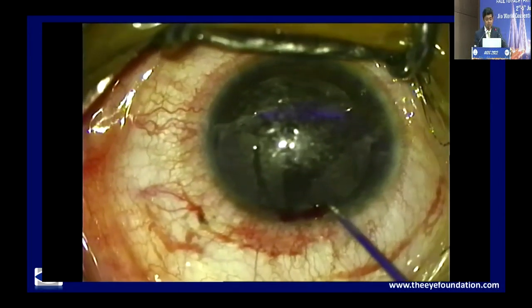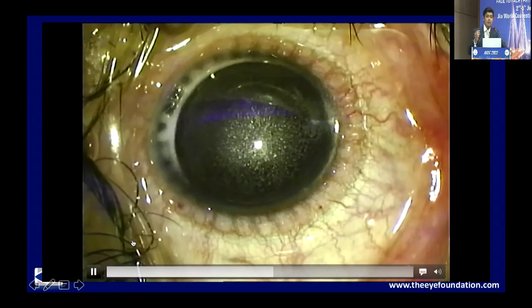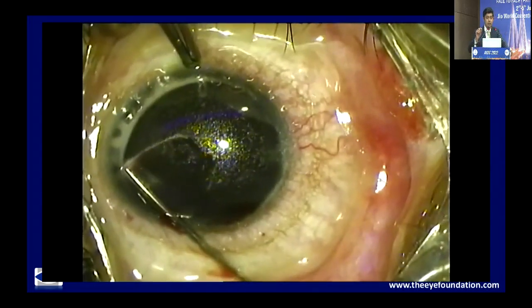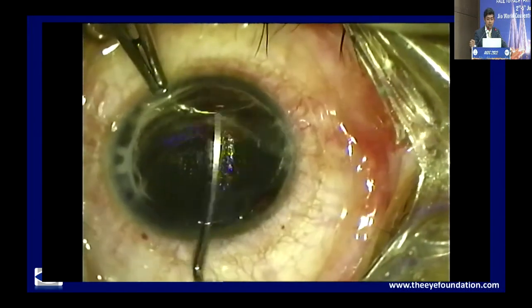And you can see that bleed there. Rest of it is quite similar. I'll move on to the other eye also because of paucity of time. One thing I realized is, I don't use any special instruments like what Sir showed. Maybe it's a good idea to use it. But if you use a Sinskey hook, which is what I'm used to using for a DSEK surgery or other things for pushing in a lenticule, the gap here is lesser.